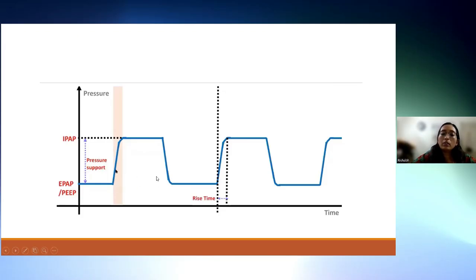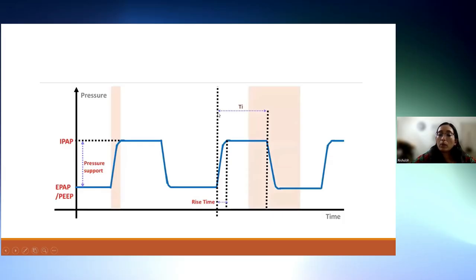And what is TI on an NIV? It is the inspiratory time that has been set.